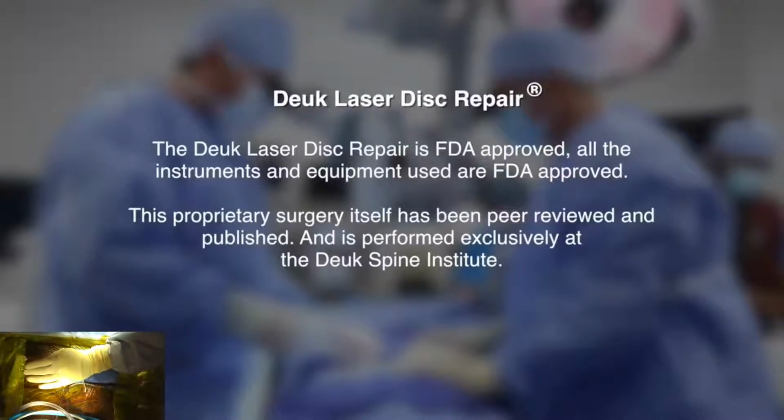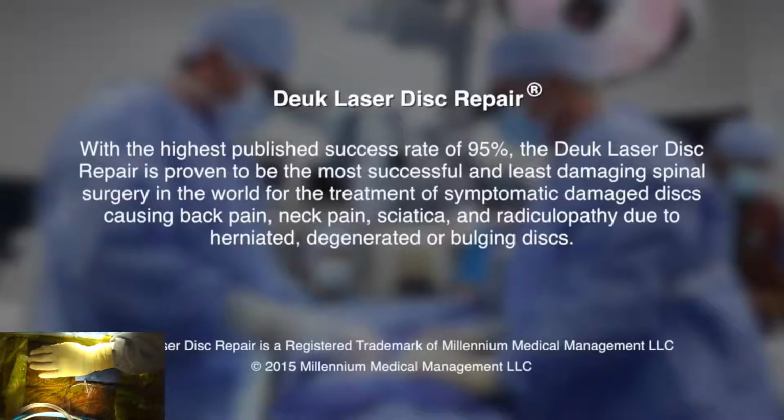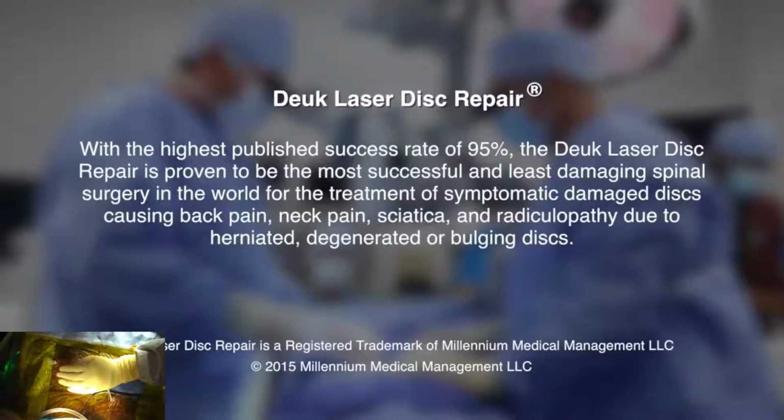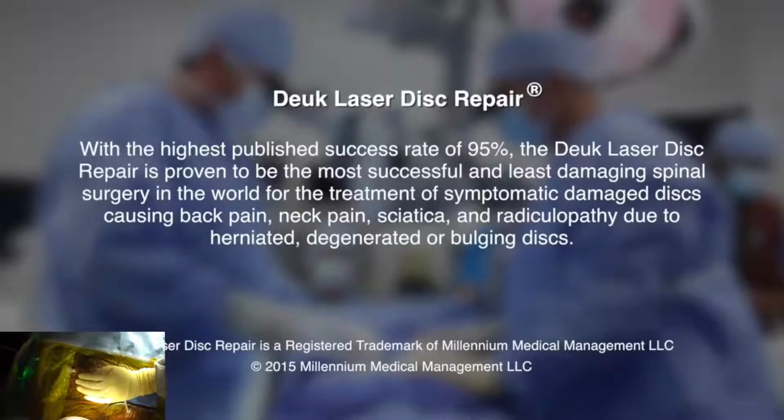With the highest published success rate of 95%, the Deuk laser disc repair is proven to be the most successful and least damaging spinal surgery in the world for the treatment of symptomatic damaged discs causing back pain, neck pain, sciatica, and radiculopathy due to herniated, degenerated, or bulging discs.